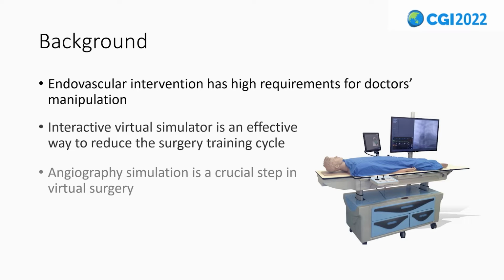Interactive virtual simulators have become an alternative for medical training. With computer-based simulators, students can practice basic skills repeatedly with multiple medical cases and computerized objective assessments. However, simulation realism, that is, how well the simulation results closely represent real-life cases, remains a big challenge. Among them, angiography simulation is crucial to improve the realism of virtual surgery. Only accurate and real-time angiography can help doctors identify vascular lesions and provide correct guidance for doctors' operations.